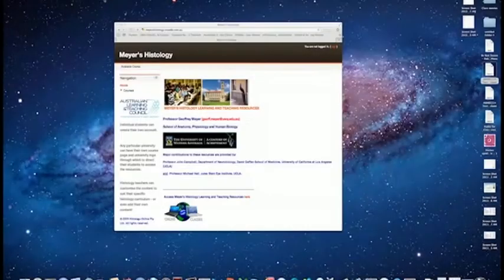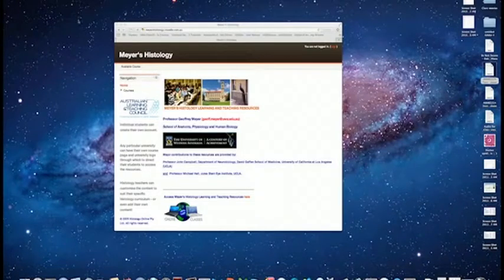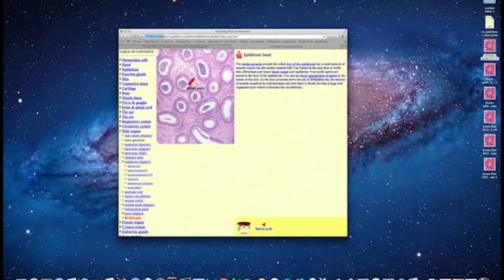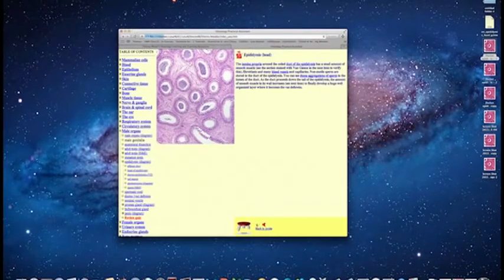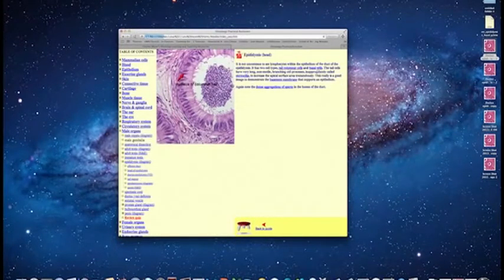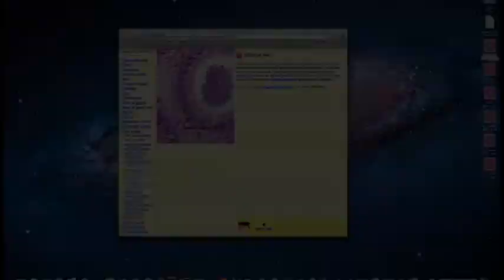Meyer's Histology contains extensive collections of resources enabling you to complete a histology course completely online, including the practical viewing of histological sections that would normally be part of your formal laboratory classes at your university.